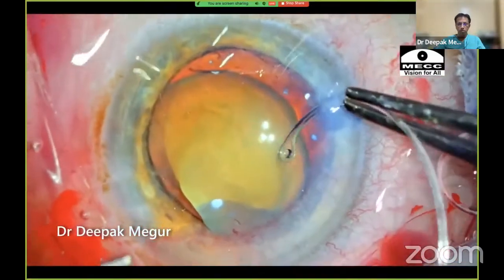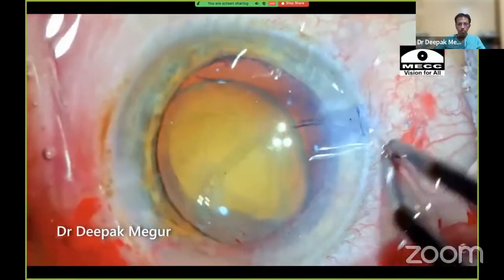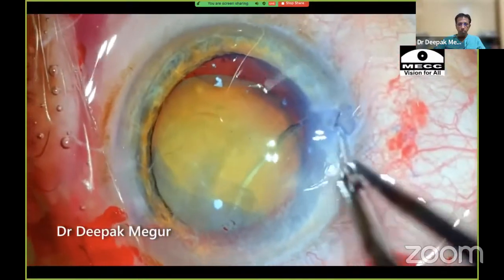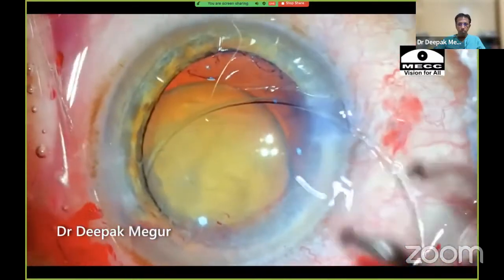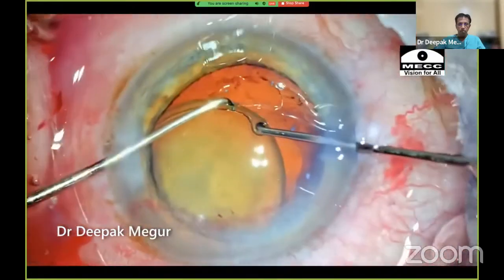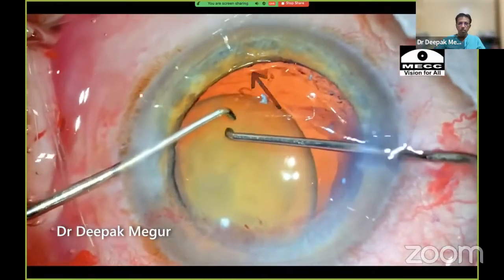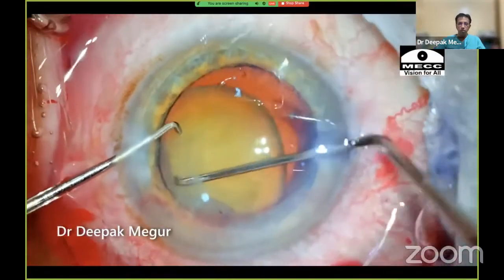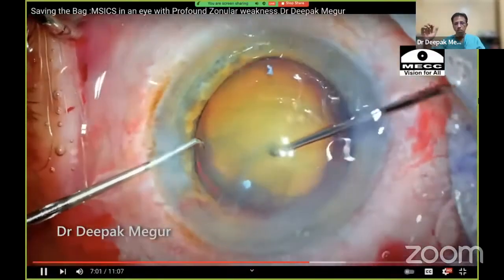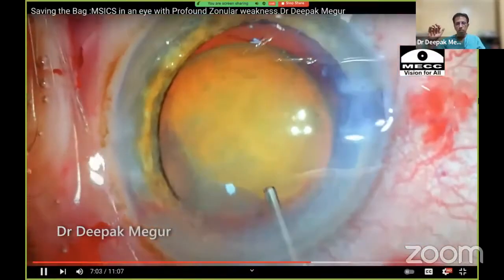This is the time to insert the CTR. It took a couple of attempts to pass the CTR under the anterior capsule edge, but eventually the ring was passed into the capsular bag. Importantly, I ensured the ring was rotated and situated in the right plane so that it supports the weak area. Once the ring is in the bag, it gives tremendous confidence to deal with the nucleus and subsequent steps of the surgery.